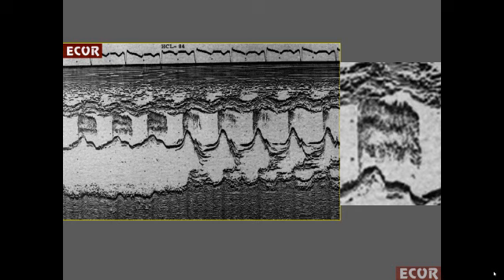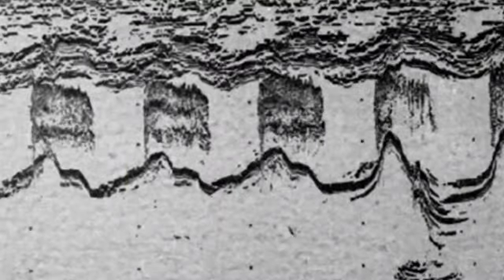Notice that it is not a large vibration as seen when the leaflet is just ruptured. This patient had infective endocarditis of the aortic valve and a large vegetation prolapsing to the left ventricle outflow tract. Here is the enlarged view of the vegetation. Notice first the torn paper sign, well seen at all moments, and the smudge. There are no lines in here, only this cloud, which is characteristic of vegetation.